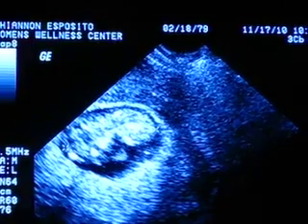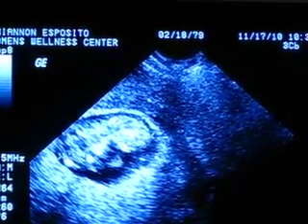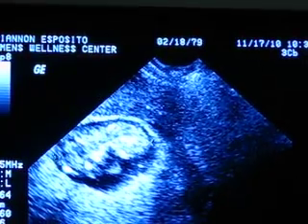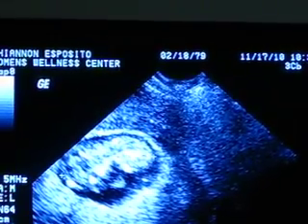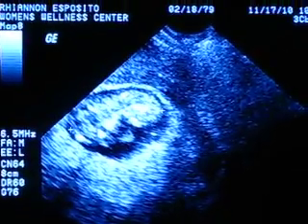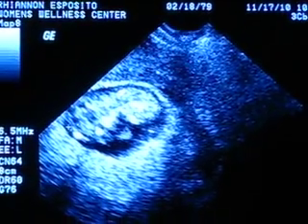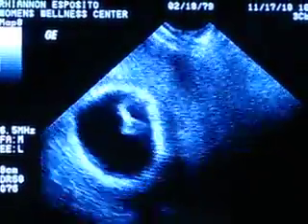There's not very much amniotic fluid, but it's normal. Baby's okay, wiggling around — normal is normal. I got you three centimeters and a third long. We'll do a couple measurements and average them, just to make sure, because this baby's wiggling so much. Let's do it again — there's your big sack.